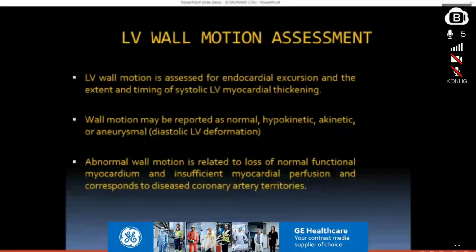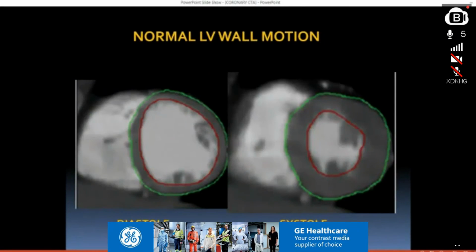Now, myocardial perfusion on CT is coming up with a lot of scanners which are using dual energy protocols or dual source scanners and scanners with 256, 320 and 640 slice systems. Our experience with myocardial perfusion is limited. Typically, myocardial perfusion is performed by giving adenosine and performing the scan under stress, followed by scanning at rest, and then comparing the myocardial perfusion in both the phases.